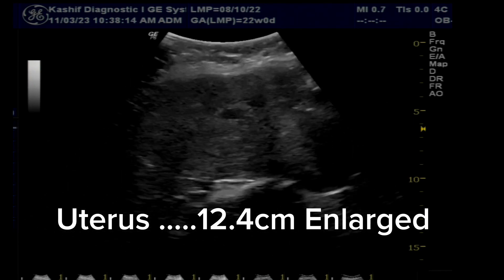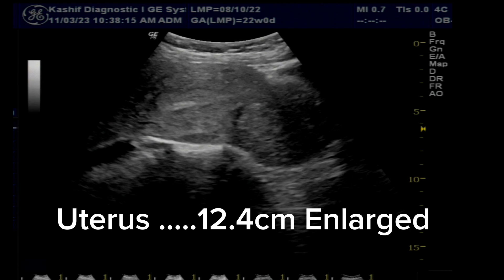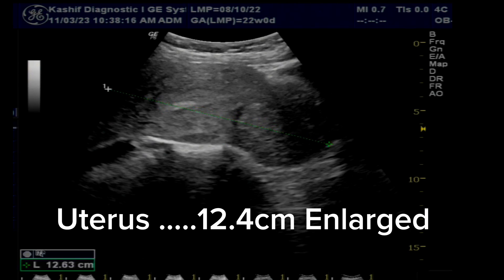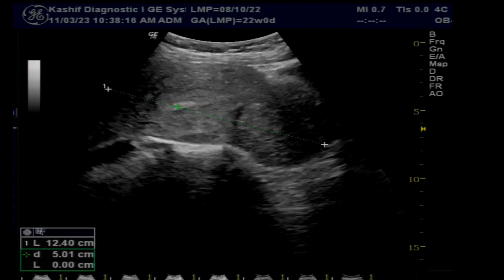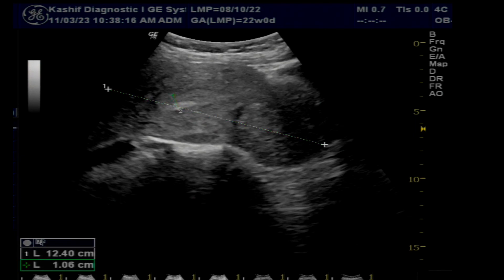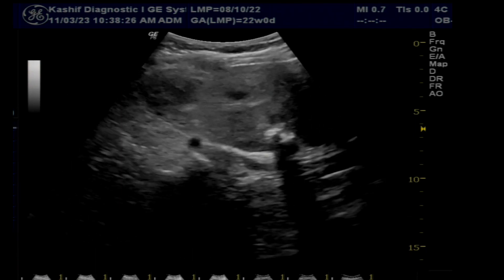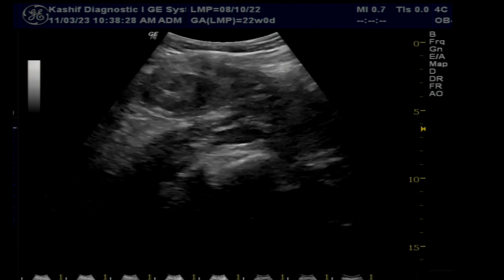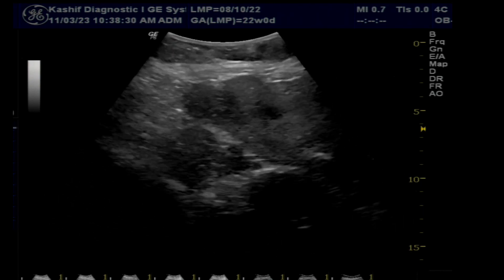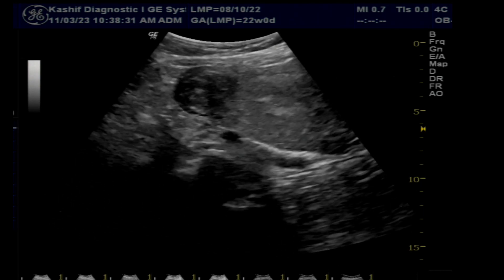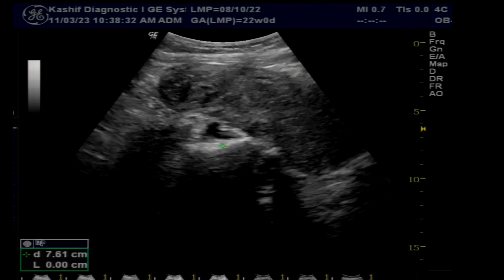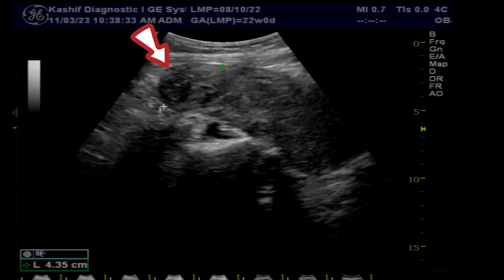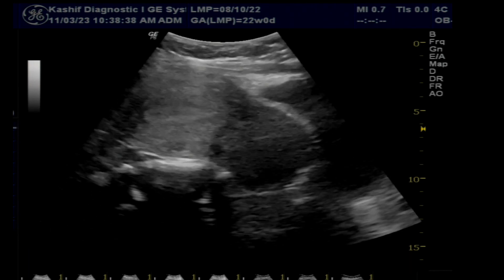The uterus is enlarged at 12.4 centimeters — normal is less than 9 centimeters. There is coarsening of the texture of the myometrial wall. Multiple fibroids are seen; the fundal fibroid is subserosal, bulging outward.